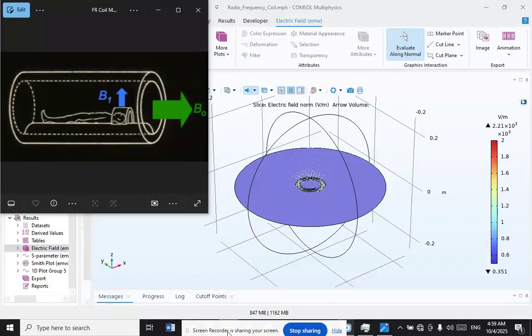Atomic nuclei of interest in MRI studies have their own resonance frequencies in the radio frequency portion of the electromagnetic spectrum. The electromagnetic fields produced by the transmitting coil are in the RF range of tens of megahertz, often in the shortwave radio portion of the electromagnetic spectrum, at powers usually exceeding the highest powers used by amateur radio.